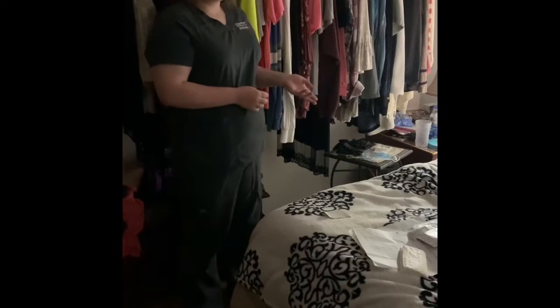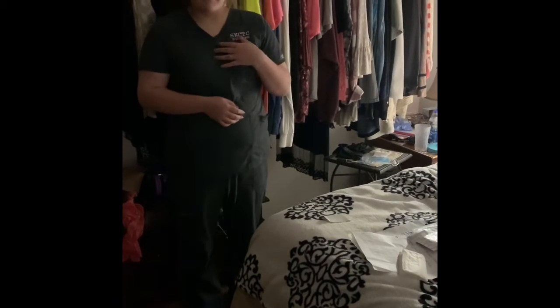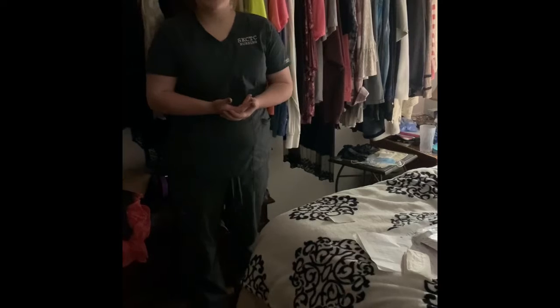I would identify and greet the patient. I would tell them who I am. I would tell them the procedure that we were planning on doing today.